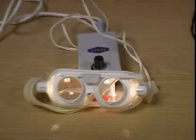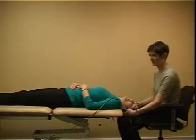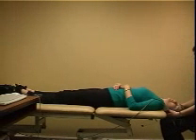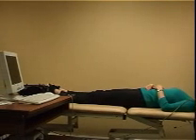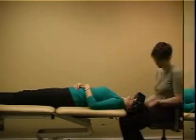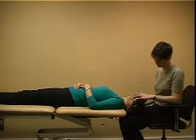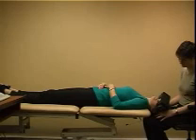For example, Frenzel glasses may be used to observe the effect on nystagmus of removing visual fixation. Electronystagmography, or ENG, can be used to record nystagmus with or without visual fixation. Videonystagmography will also record and analyse eye movements, again with or without fixation.